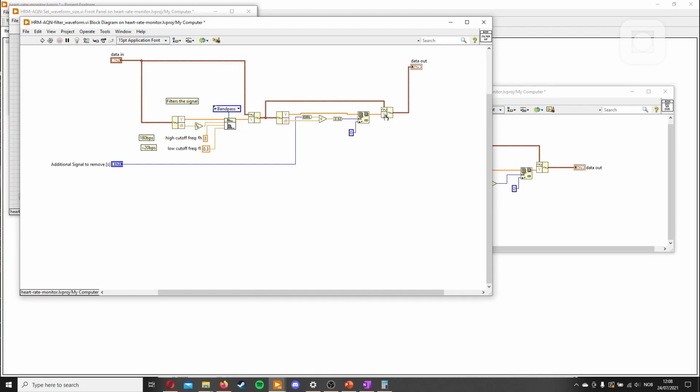We just edit what we want. We could make a new waveform rather than edit the waveform we're using, but since all the metadata or the additional data connected to it is in the wire, it's better just to leave it be and only edit what we want to edit. So now we have found a way to remove the additional signal. So just add that here.